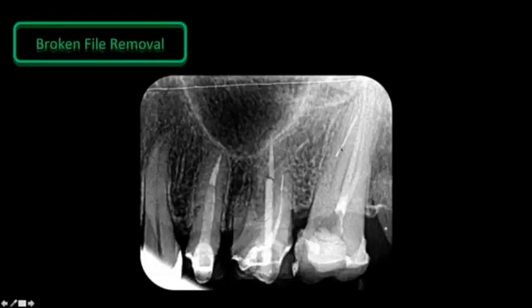On the other hand, when we have a second molar, this is a case with a stainless steel file. This is a stainless steel file separated on a second maxillary molar. This is extremely difficult for a maxillary tooth. And we can see that we have a separated instrument and a distal root of the first molar that we didn't treat yet.